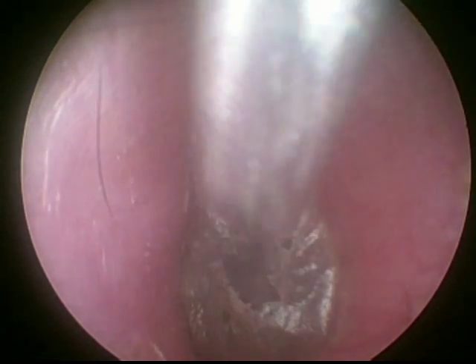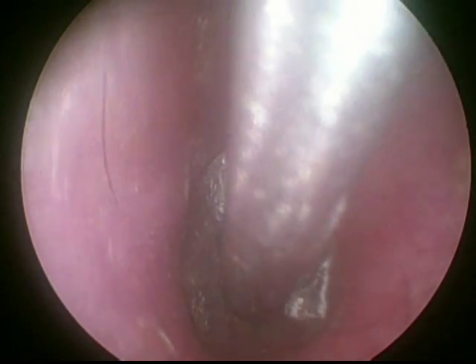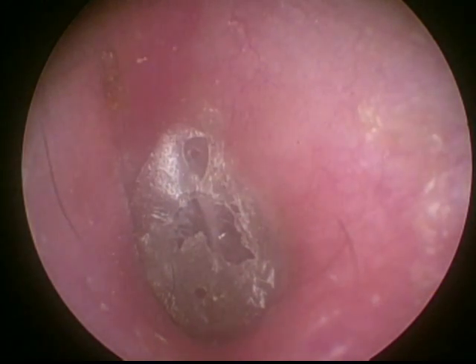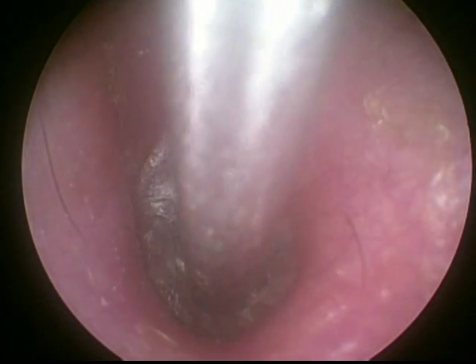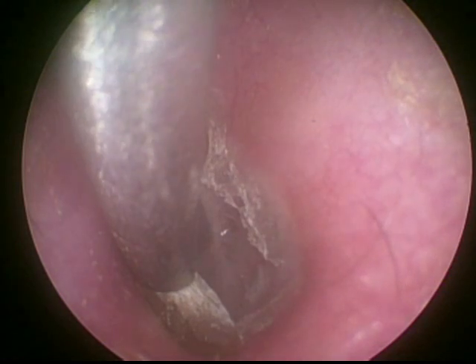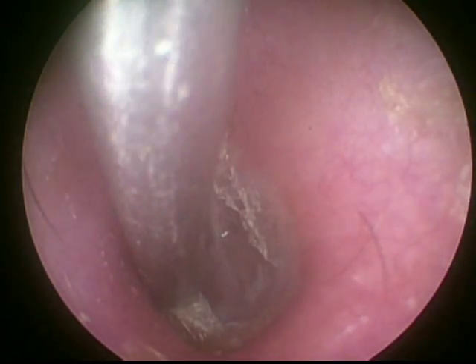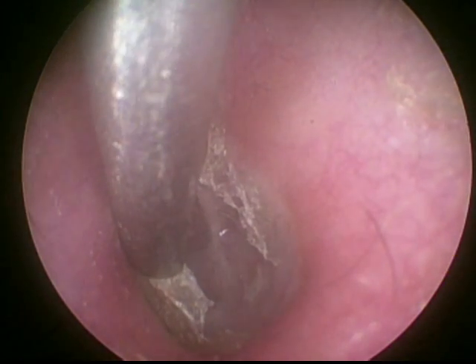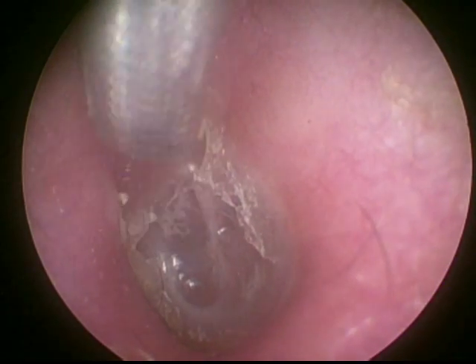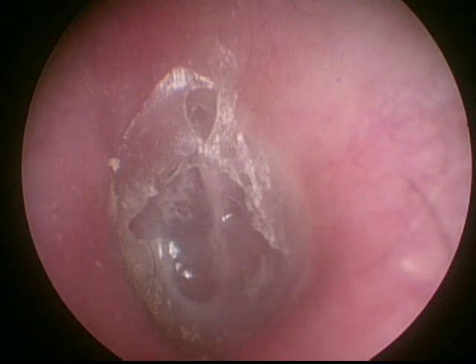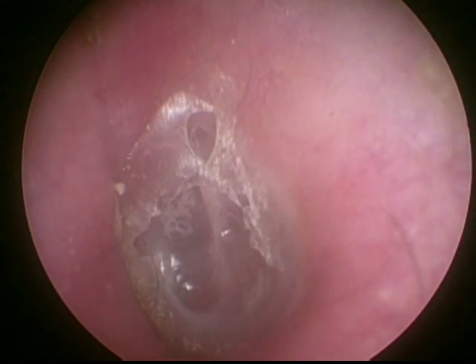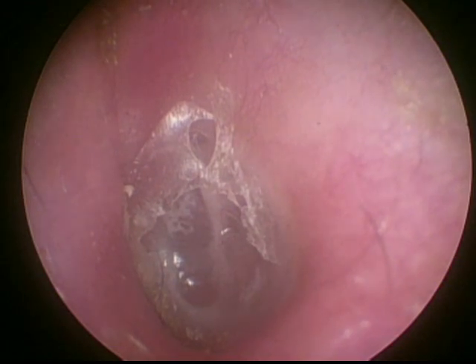We remove it slowly and you can watch the tympanic membrane behind this squamous cast. This is a typical squamous cast which we came across in certain cases. Watch the cast being removed gradually — now you can see the tympanic membrane behind this cast. This is a typical diagnosis of a pseudo membrane.